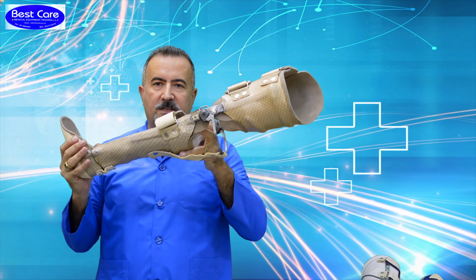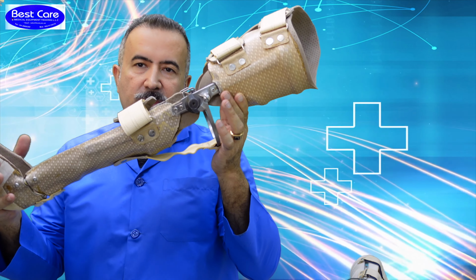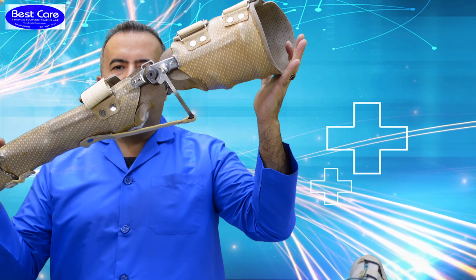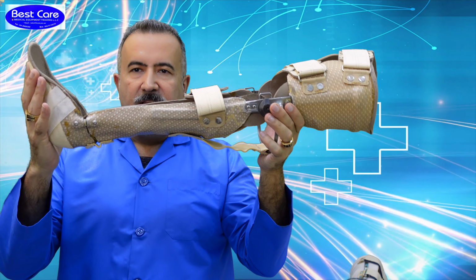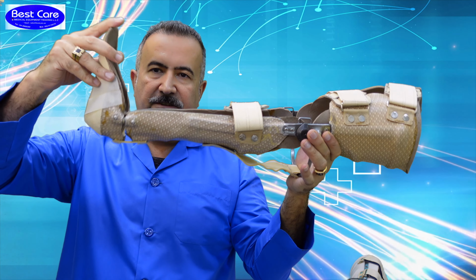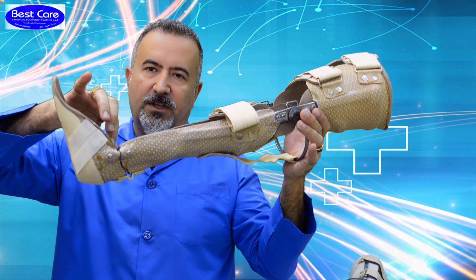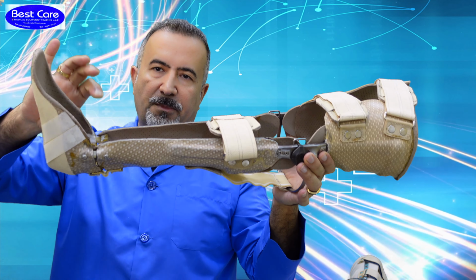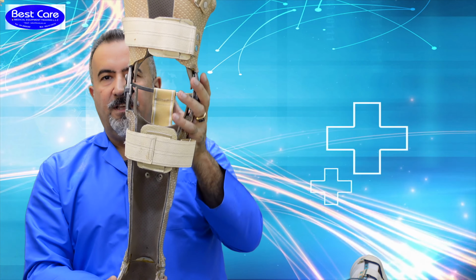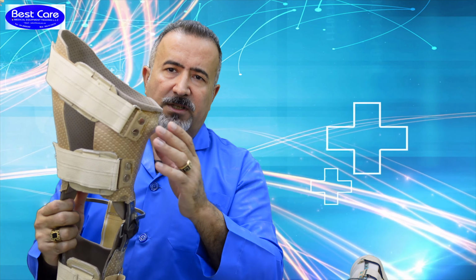In the last one, which is my favorite to show you, I have used the same joint again because it's all made as a sample to show you for presentations. In the down portion, plantar flexion and dorsiflexion is possible. And the material we have used as a joint here is a Tamarack joint, because the patient is very stable and therefore we need just to have this movement here.